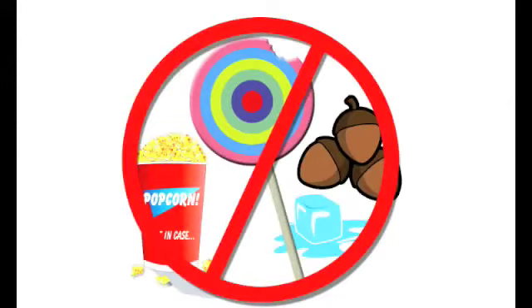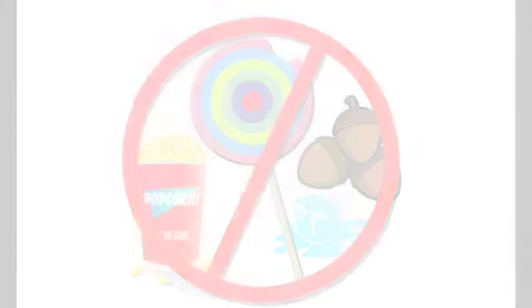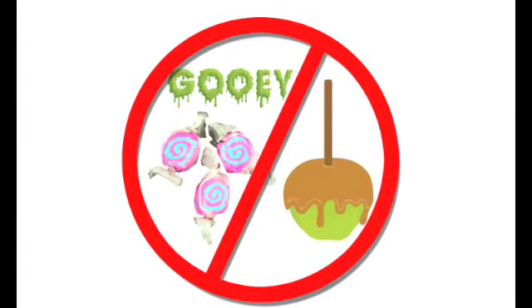Foods to stay away from while your expander is in your mouth include hard foods such as nuts, popcorn, hard candy, or ice to prevent damaging the device. Also, some gooey foods such as taffy and caramel can pose a risk to a successful expansion process.